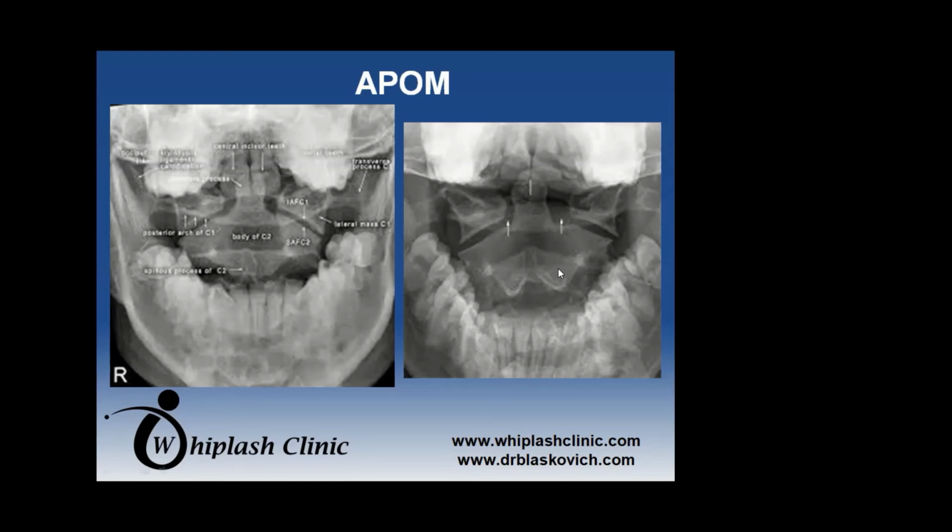And the other thing with this, when I talked about the side margins of C1 and C2 lining up, you can see that there's an overhang right here. So this lateral mass overhangs the side part of C2. Do you see that right here? Yeah. They're not lined up in verticality. So this is the side edge of C2. That means the side edge of C1 should be just above that, but it's all the way over here. Can you see that now?